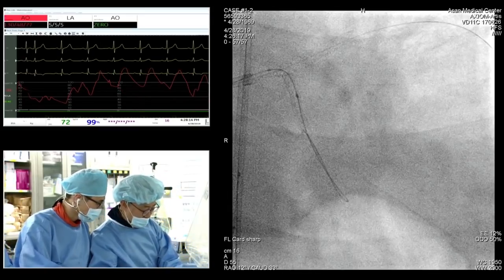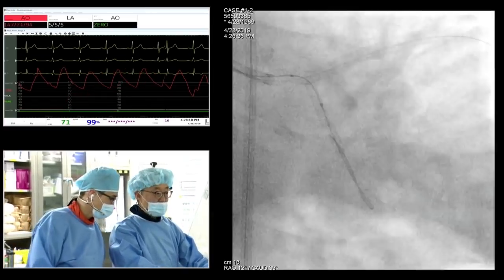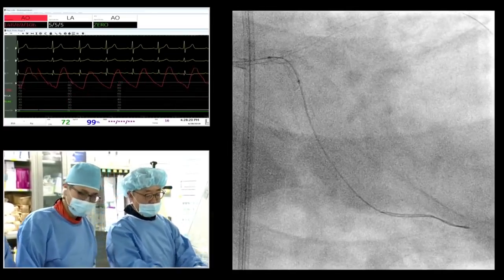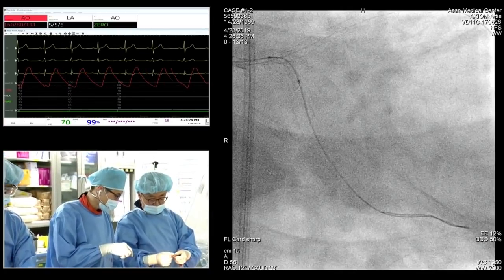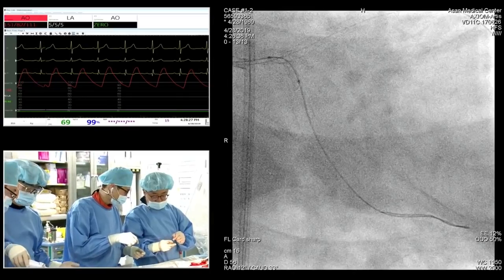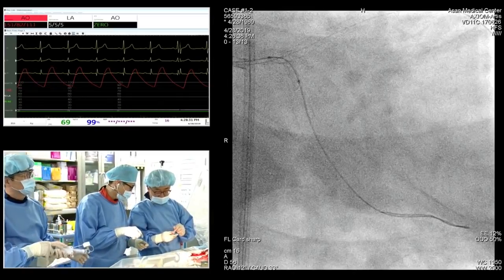Okay, this is a used one. All right. Yeah, Dr. S.J. Park. So, because this is the balloon crush technique, right? Usually we can use 6 French guiding. So why does Dr. Park use the 8 French guiding catheter? All right. I think it's just a habit.